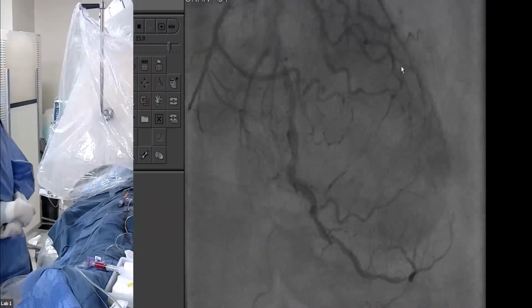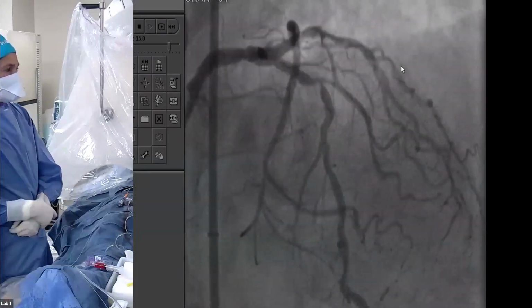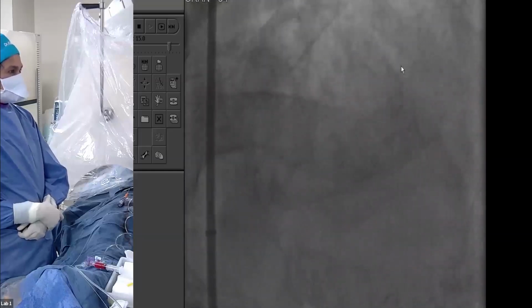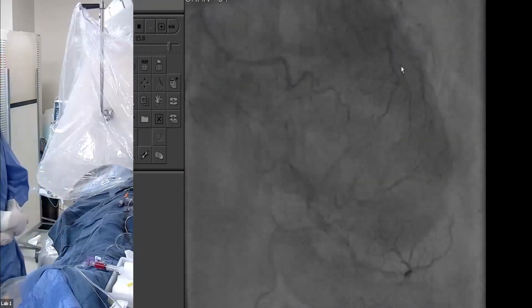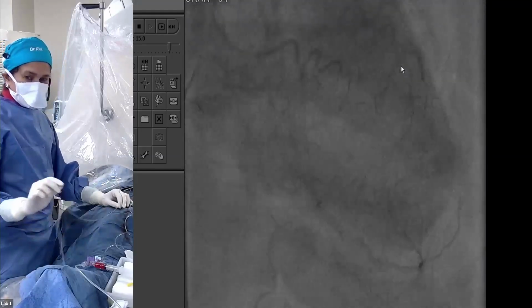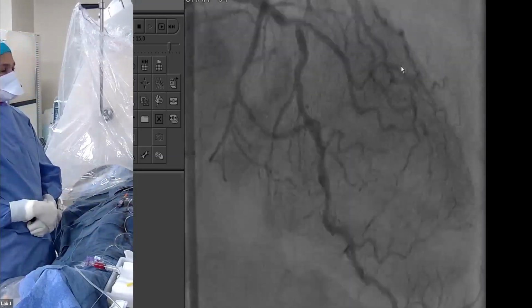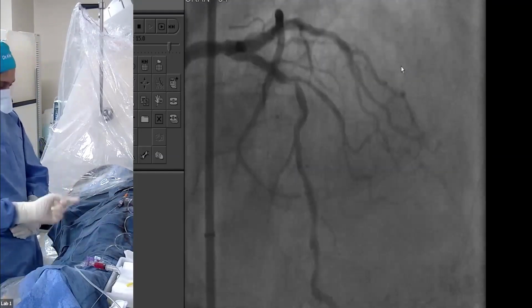Oh, okay. With this, yeah. I see lots of calcification. I don't know about the lesion, but certainly lots of calcification. We have a wonderful panelist here. Who wants to start? Before we go anywhere, this is a bifurcation lesion, looks calcific. I know Dr. Kinney could fix this in about 15 minutes, but let's see what other people are thinking about.